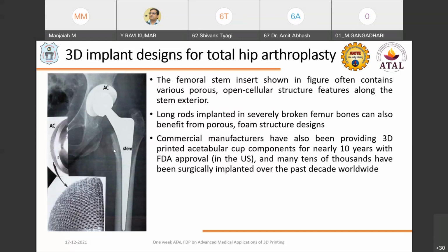These kinds of things can be made with the 3D printing process, because total hip implants experience complex variation with respect to multiple stress modes, and it is often cyclic as well as high fatigue stress, especially when we are talking about wide patients. They have different weight-to-body ratios and motion mechanisms, and it is very personalized. That's why 3D patient-specific fabrication is required.